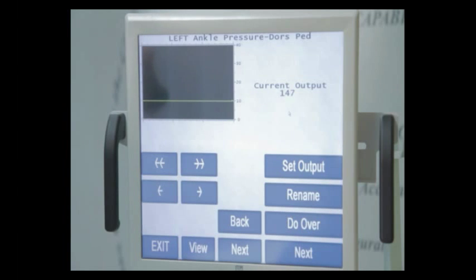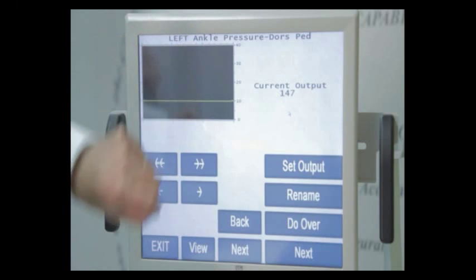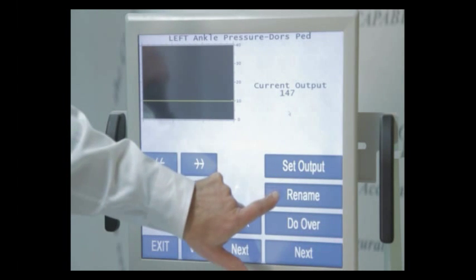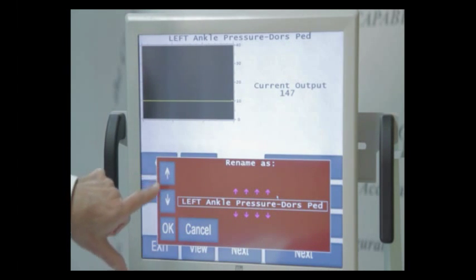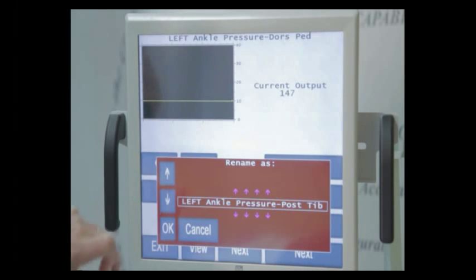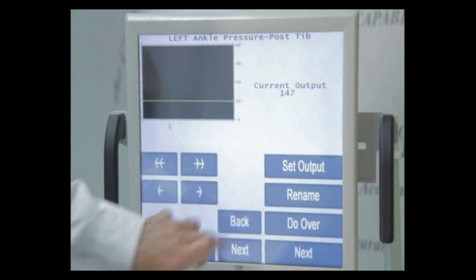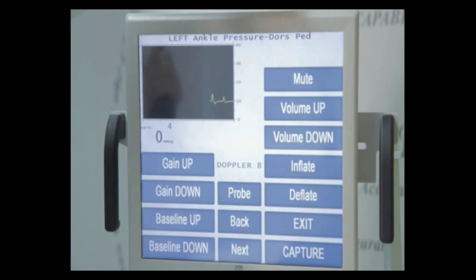This is where we can use the rename function. If you do have a good pressure, but it's not where the machine thinks you are, simply press the rename button. And then right now, if I advance this, it's saying left ankle dorsalis pedis. I simply move that to posterior tibial and press OK. Now I press the back button, locate my dorsalis pedis, and repeat the process.